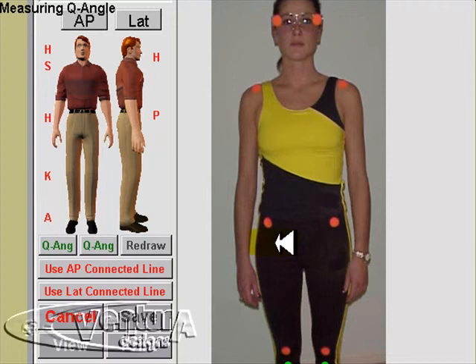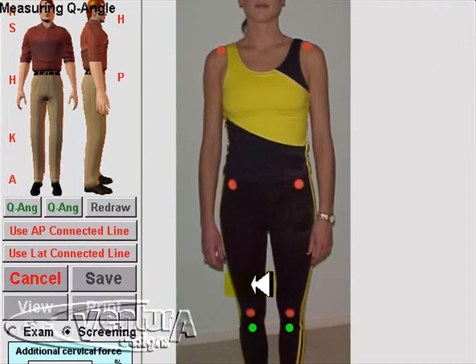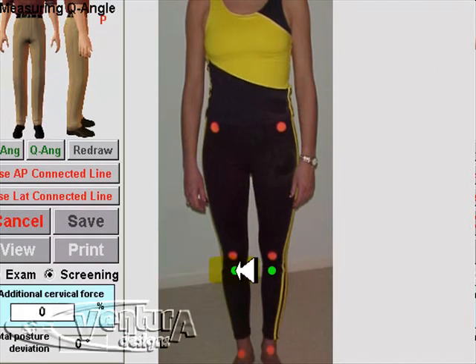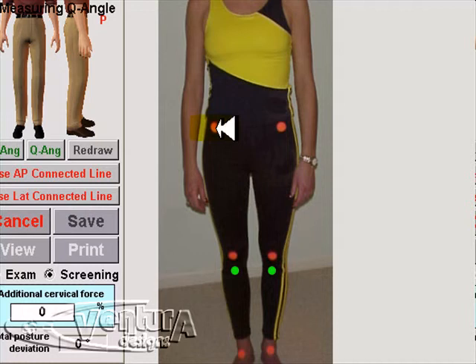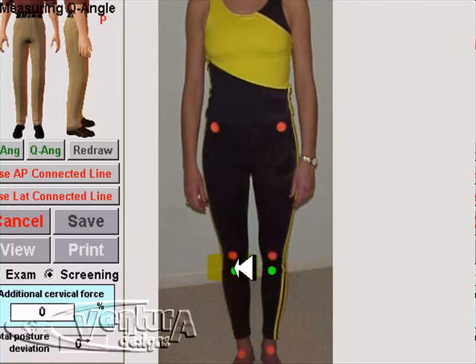You'll notice on this picture we have marked the tibial tuberosity with a different colored dot. This is so it won't interfere with any auto-detect exam that you may perform. You will want to palpate and place a dot at the ASIS, the center of the kneecap, and the tibial tuberosity to measure the Q-angle.